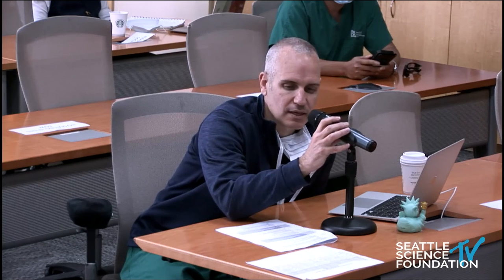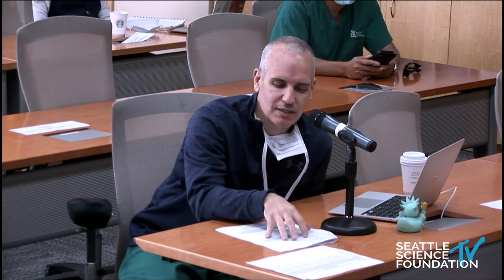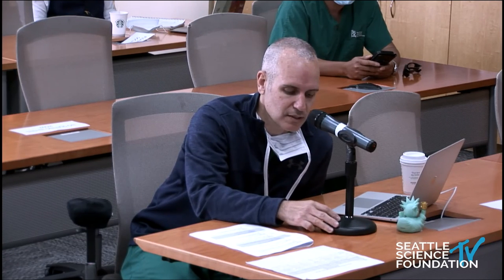Great presentation. Dan Schuppe here. Question I have is, as what we find is there's always a trade-off with these things, especially biomechanically. There is no secret, right? The secret is there is no secret. So as we put in more rods, and maybe you alluded to this a little bit in some of your cases, and we increase the stiffness of that area, are we also increasing the distal and the proximal kyphosis and failure? And if that's the case, do you have any pointers as we start using more rods and we start seeing more revisions and what have you?